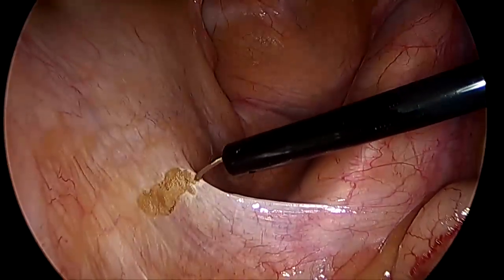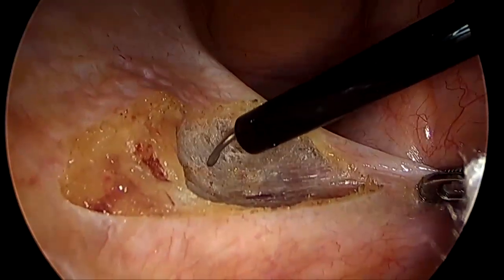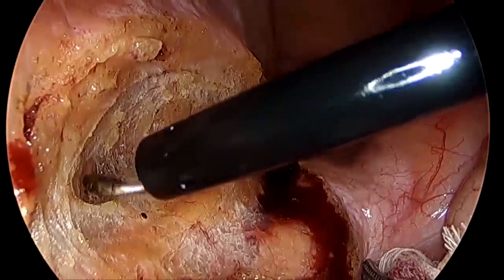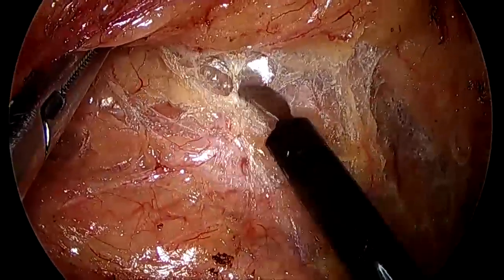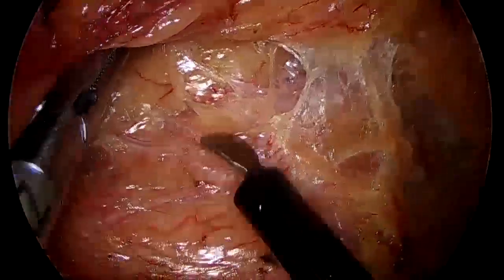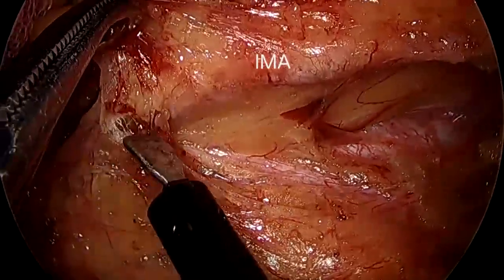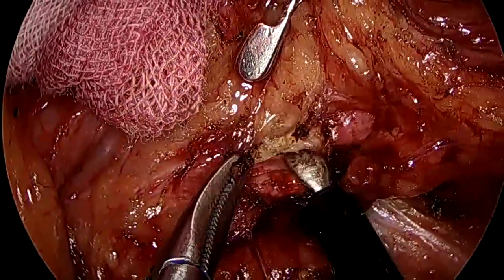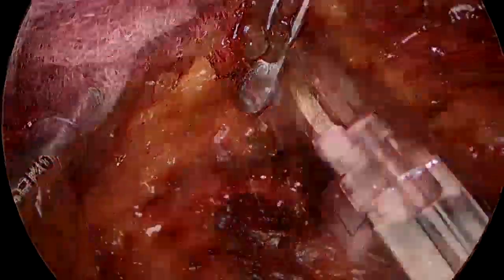First, we started the incision on the right side of the upper mesorectum. The loose fibrous layer between the mesorectum and pre-hypogastric nerve fascia was dissected. Ventral traction of the IMA pedicle extended the fibrous tissues behind the pedicle. Incision of the peritoneum was continued up to the root of the IMA, which was then clipped and divided.